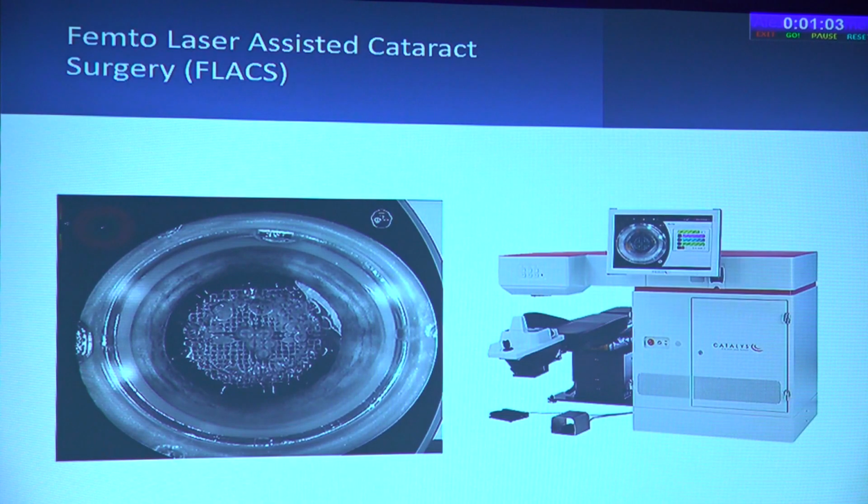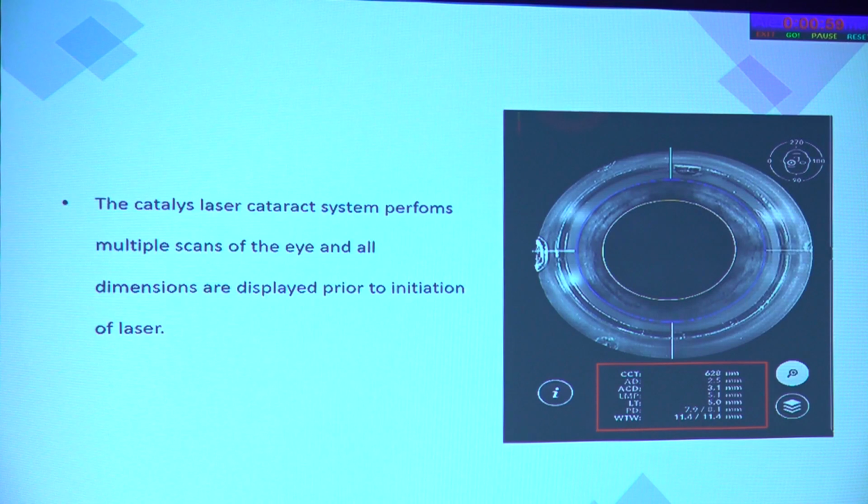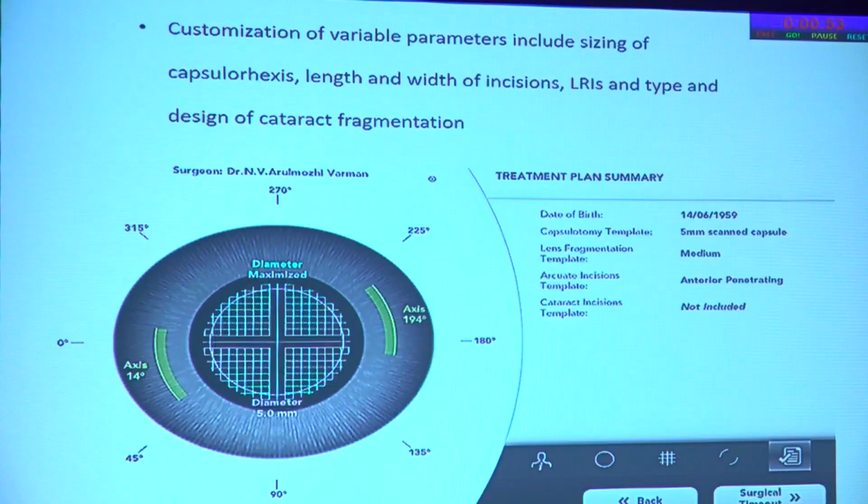The next technology I wanted to speak about is the femtosecond laser. As you know, this also uses a type of imaging. It's OCT-based imaging and performs multiple scans of the eye, and all of the dimensions are displayed prior to the initiation of the laser. You can go ahead and do your LRIs, your incisions, your rexis, and your nuclear fragmentation patterns as well, all of which can be modified according to the surgeon's preference.